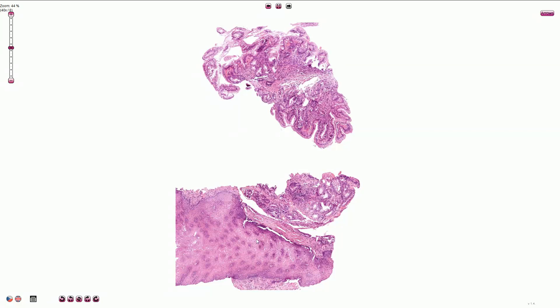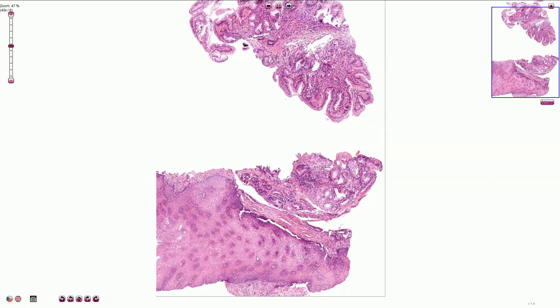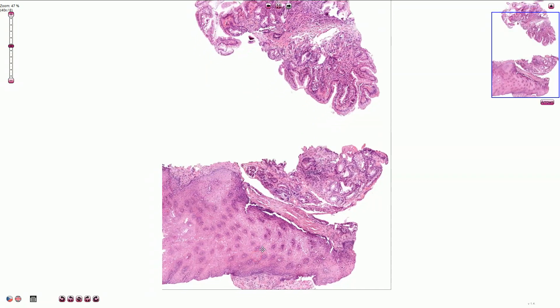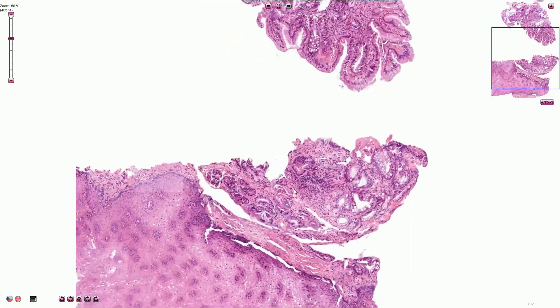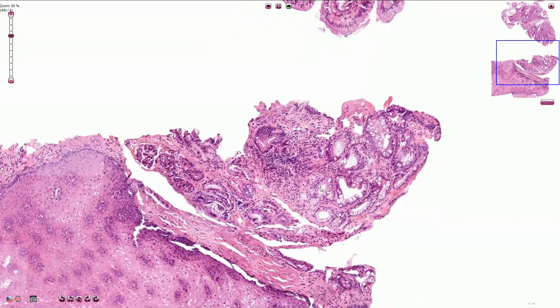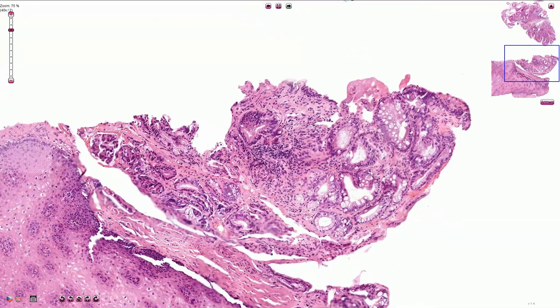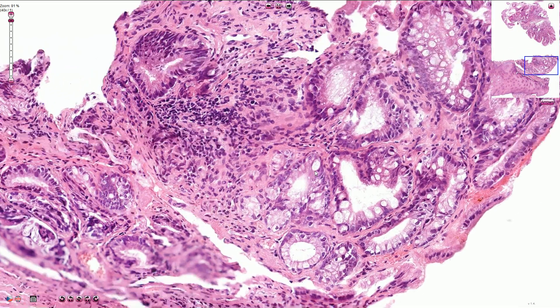The normal stratified squamous epithelium of the esophagus is well-suited to handling the friction of the food bolus, but it can be injured by an acid environment. The chronic injury then leads to intestinal metaplasia. The metaplastic epithelium consists of multiple glands lined by columnar epithelium with goblet cells.